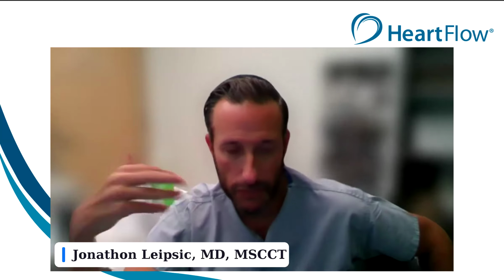When we ran too quickly with cardiac CT in 2005, 2006, and 2007, we didn't necessarily have the evidence or the data, and we were perhaps overly ambitious and excited, and we ate humble pie. So I think the thoughtful integration of plaque is going to be very important: acquiring the data appropriately, using CT in a thoughtful way. If we're tracking treatment response, we obviously need to visually inspect those CT data sets as well.